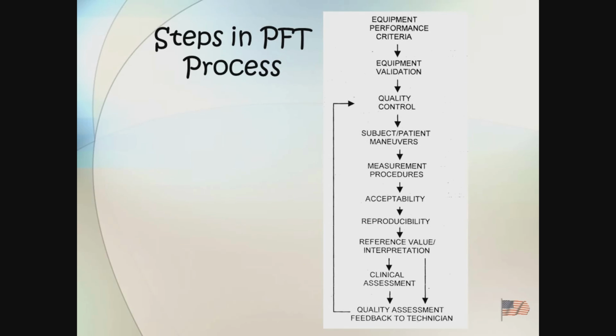We'll then do some patient maneuvers, we'll do some measurements, we'll verify that these measurements are acceptable and reproducible, and I'll explain what the difference between those two is. And then compare it to a reference value to interpret, and based upon that, some clinical assessment will be made.